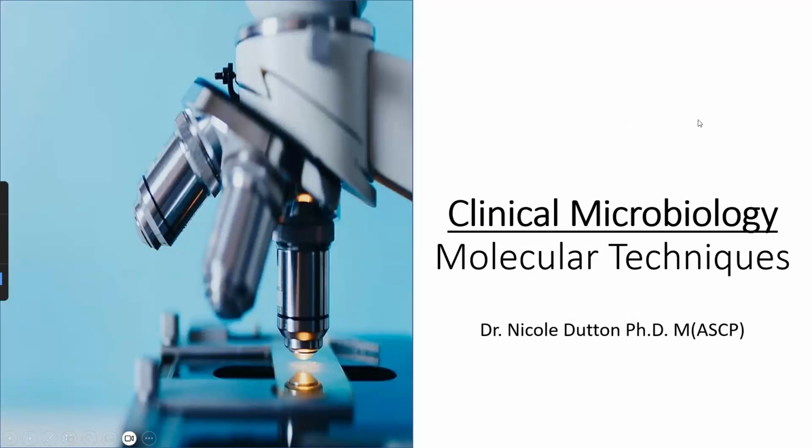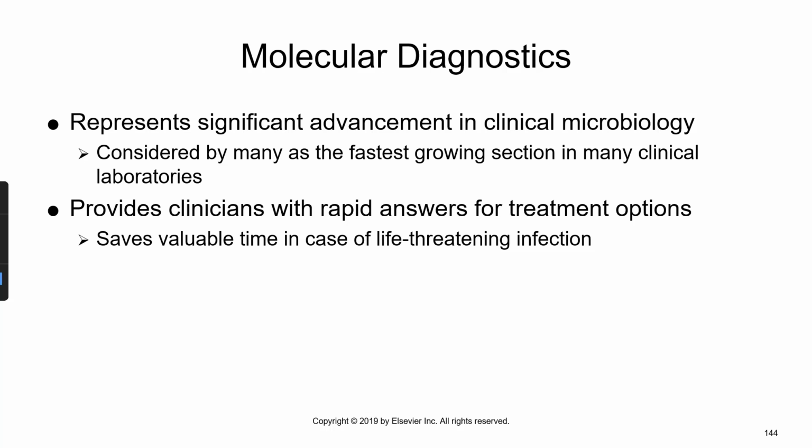Molecular techniques. Molecular diagnostics represents a significant advancement in clinical microbiology, and it's considered by many as the fastest growing section in many clinical laboratories. It provides clinicians with rapid answers for treatment options and saves valuable time in cases of life-threatening infection.